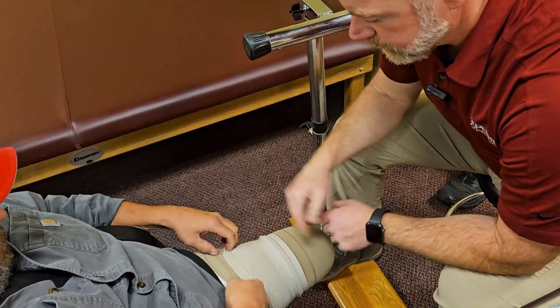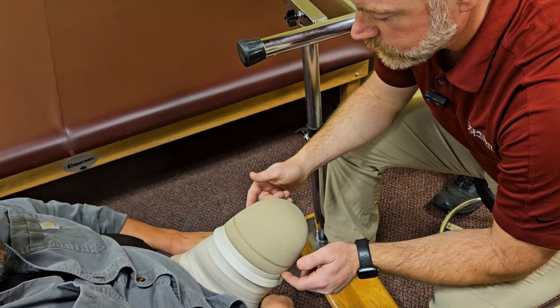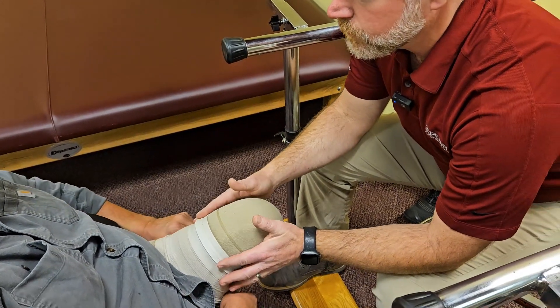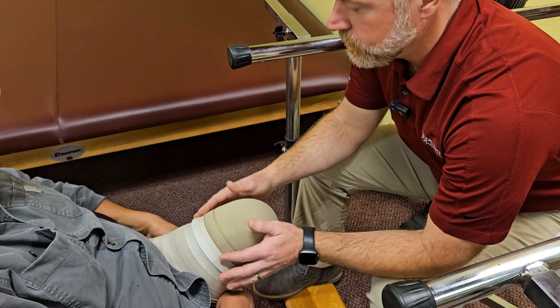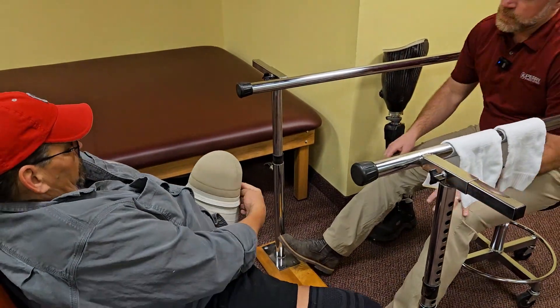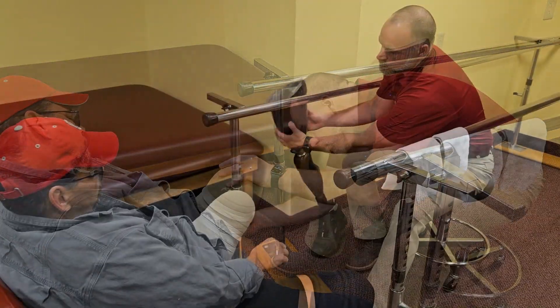Smooth out all the material the best you can all the way around. The individual rings on the liner help grip this ring to keep it in position.